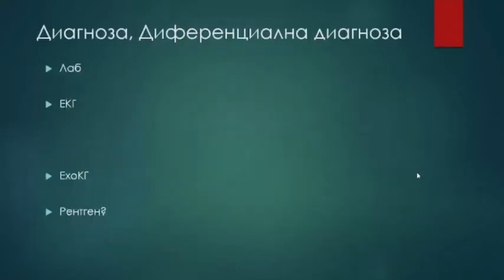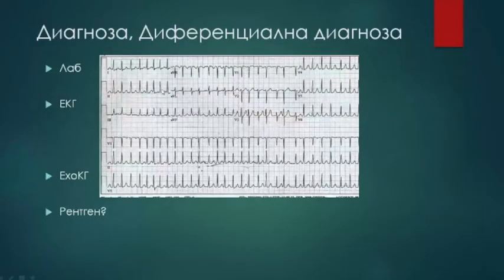Exactly. Yes, 60. So we have defined that the patient has atrial fibrillation. His heart rate is around 200. His axis is normal or indifferent, around 60 degrees. So what else? There are no visible ST-T abnormalities. The ST segment is on the isoelectric line. There is no ST elevation or depression. The T wave looks normal almost everywhere.